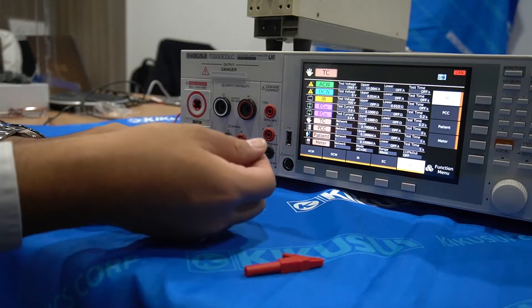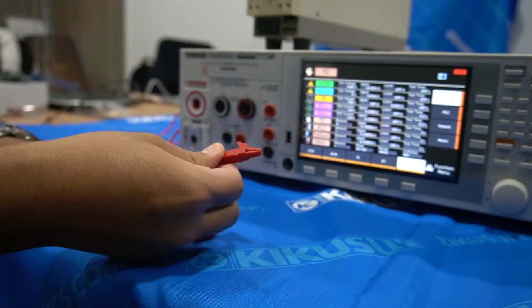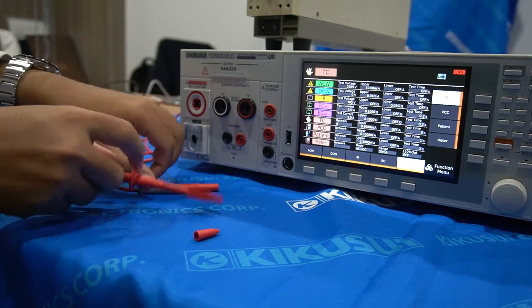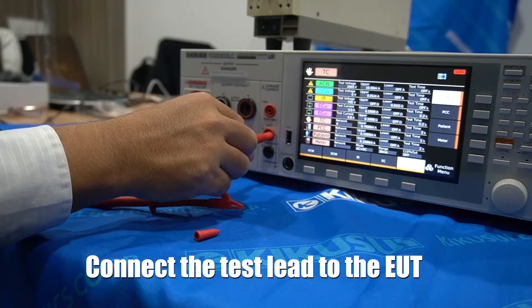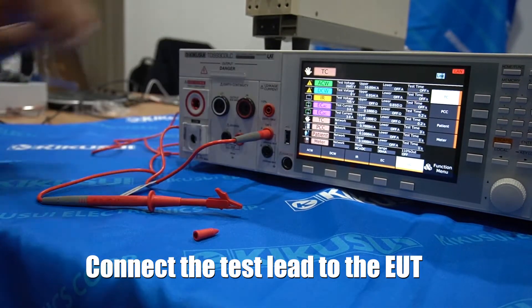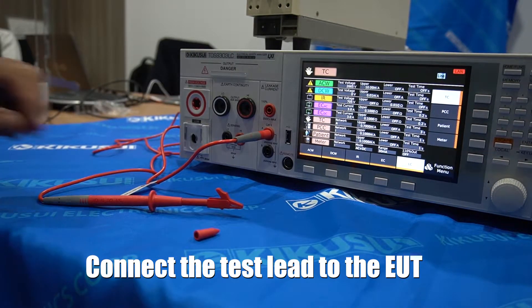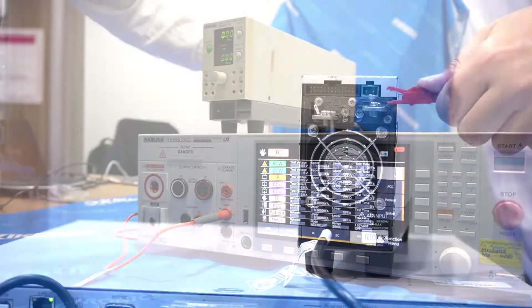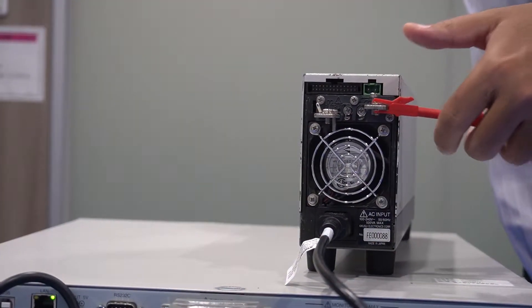This is the test lead for the TOS9303LC. Instead of using a pin connector, you can use a clamp-style connector. Connect the leads to the A-probe terminal, which is color-coded for your convenience. Clip it to the EUT chassis.